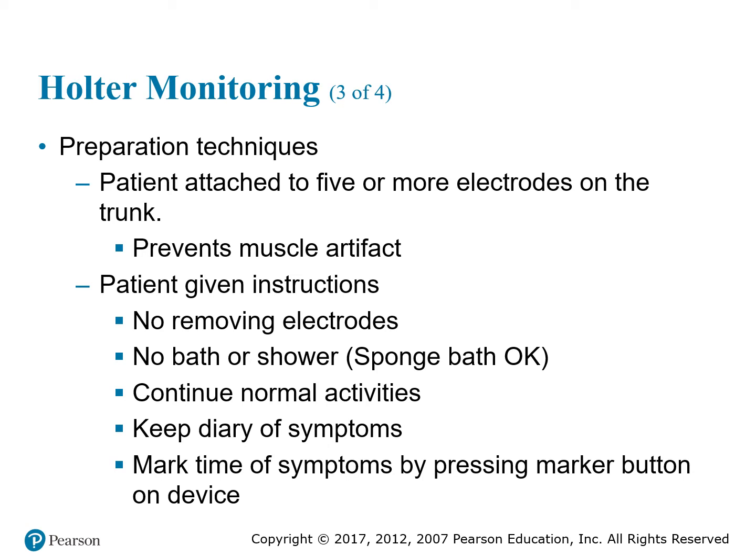All right, so the first step in reducing the fear is to help them understand the procedure. So you want to make sure you explain it clearly and concisely to them. Try not to use too big medical terms. Try to keep it down to their level. Take time with the patient to explain each step of the procedure as you perform it. As you're putting on the Holter monitor, just explain to them what you're doing to keep them at ease and mindful of what you are doing.